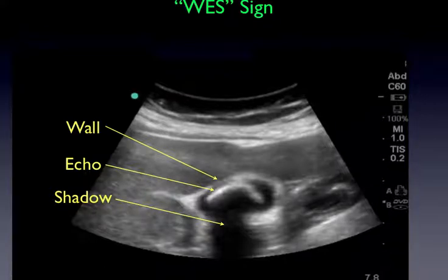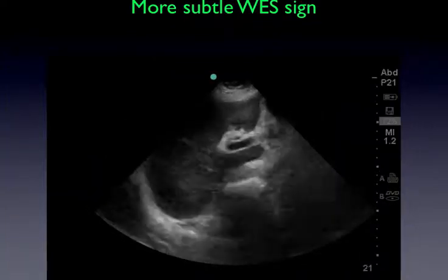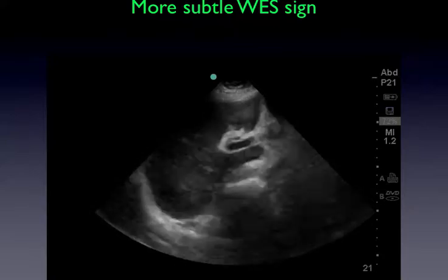Now this is an unusual clip that I've just showed you in terms of clarity. Normally, the WES sign is not this apparent. So this is a more typical WES sign. Much more subtle, but this is actually how it typically looks.